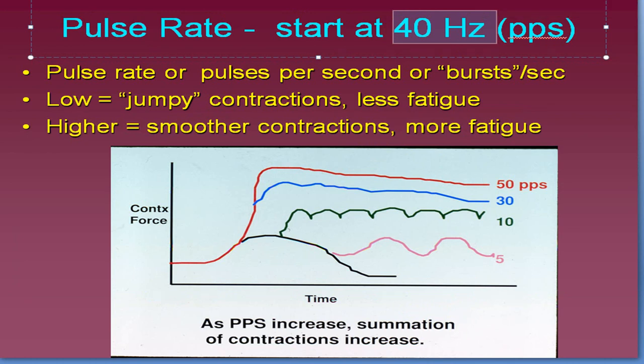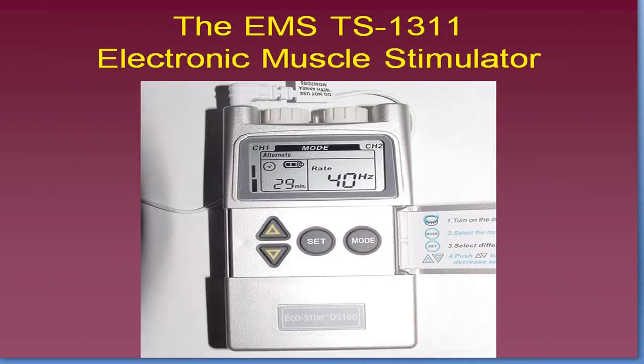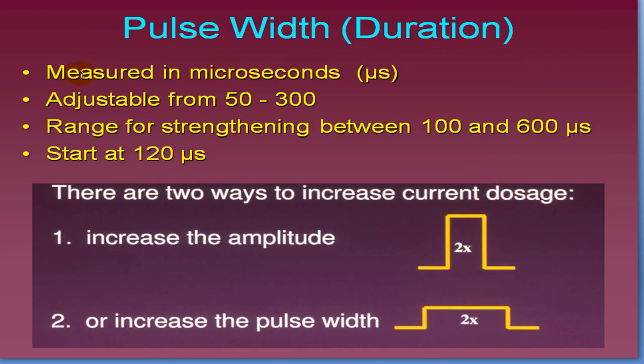It's back on the machine at the rate. Okay, this rate here, that's the hertz, 40 hertz, that's 40 pulses per second, and you can go up and down from there. Pulse width is a little bit different concept. It's measured in microseconds. It's adjustable from 50 to 300. The range for strengthening is between 100 and 600. This is not something I suggest that you change a lot. I would suggest starting at 120 microseconds and not varying that too much.